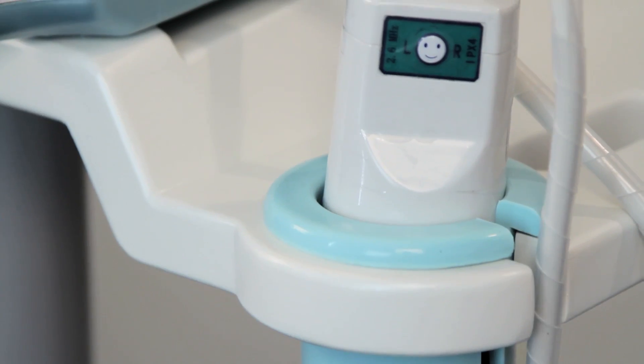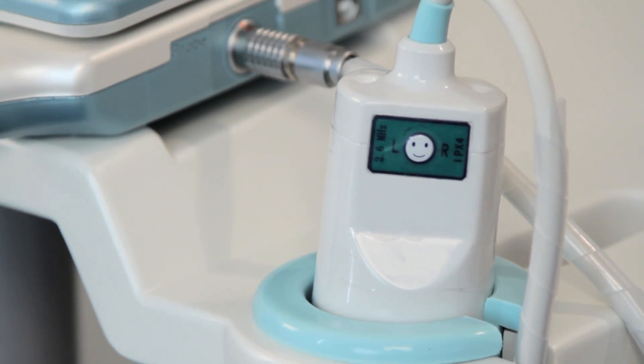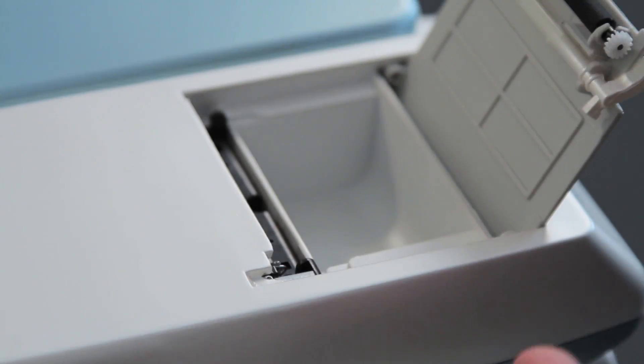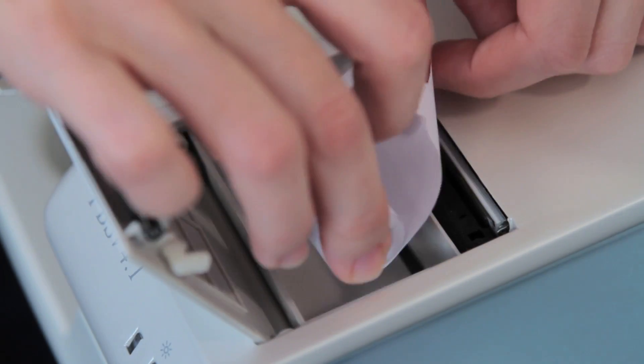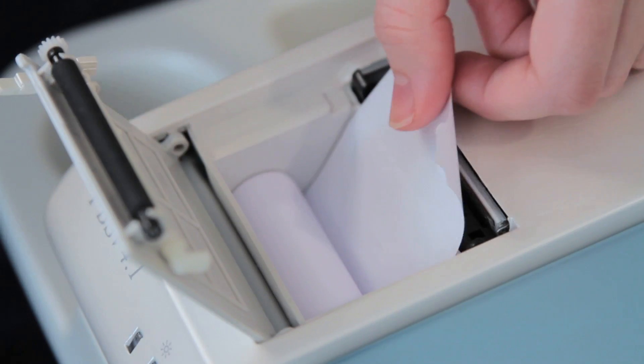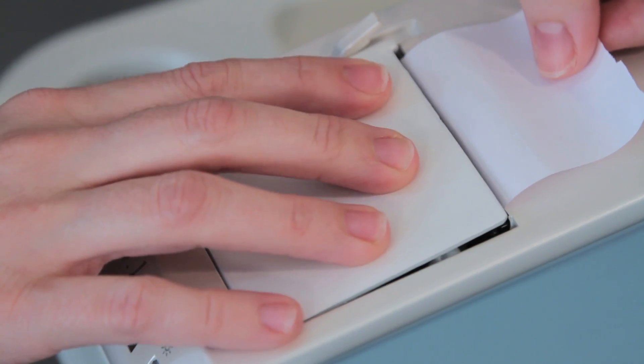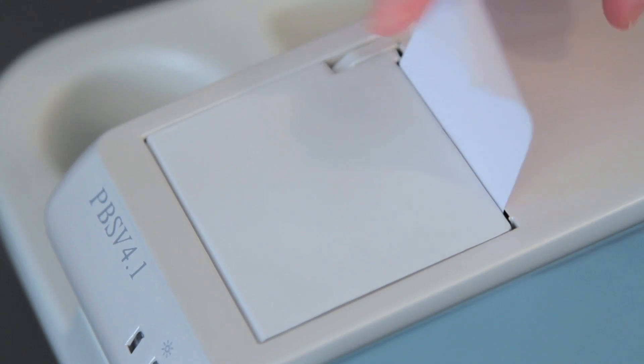Only the probe supplied by the original manufacturer may be used with this device. To add paper to the onboard printer, open the printer door by lifting the latch. Put the paper into the paper box with the roll facing the top of the device. Pull out the paper so that it is exposed when you close the door.